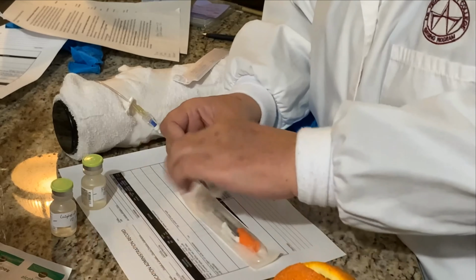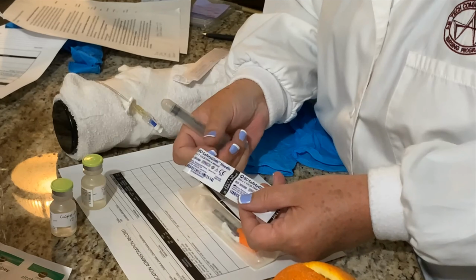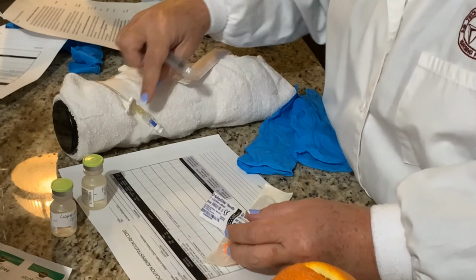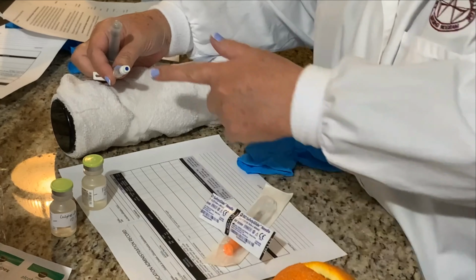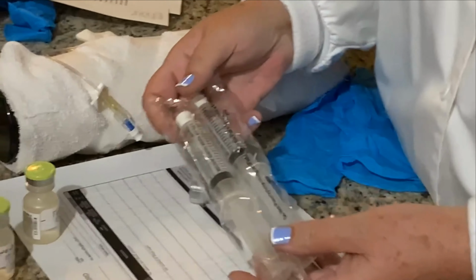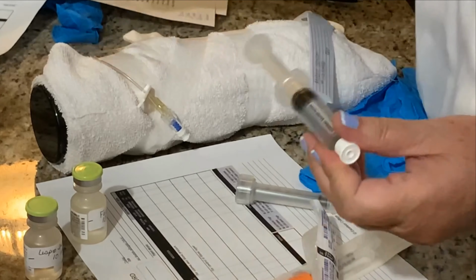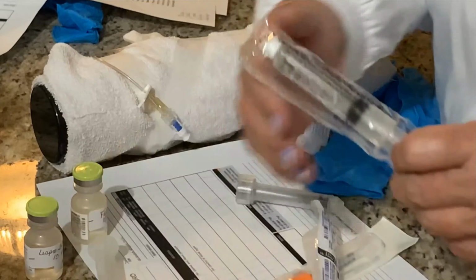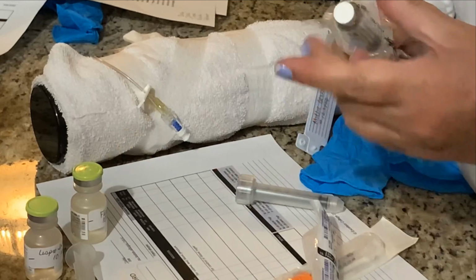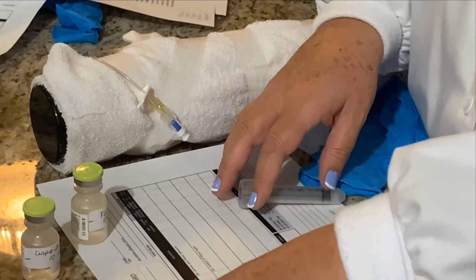And then, of course, I have a syringe and a needle for my IV push. It doesn't matter what size needle that you have because IV push it's a needleless system. So we're not going to be putting a needle in there. Also, you want to make sure that your IV site is correct, connected, right? This is the end that you put the medication in. And I also want to make sure that I have 2 IV flushes. And I can go ahead and open these because they're covered with a cap, so I can lay those down. Okay, so I've done my first check.